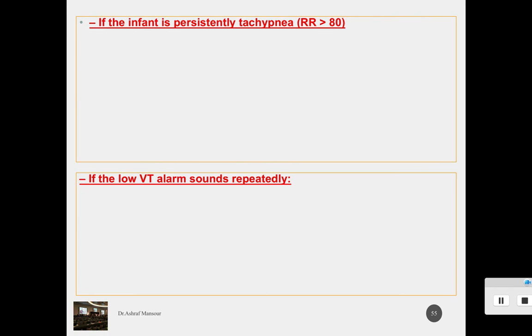look at the setting and the measurements coming from the baby. You know your baby. Is the baby improving enough to be extubated or not? Or maybe the baby still needs support and even more support, because what is important for the baby is not the tidal volume, it is the minute volume, and the minute volume is equal to the tidal volume multiplied by the respiratory rate. So the baby is increasing his respiratory rate and becoming tachypneic because he wants his minute volume to be normal.